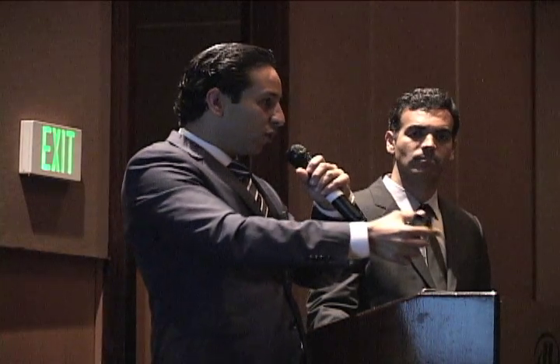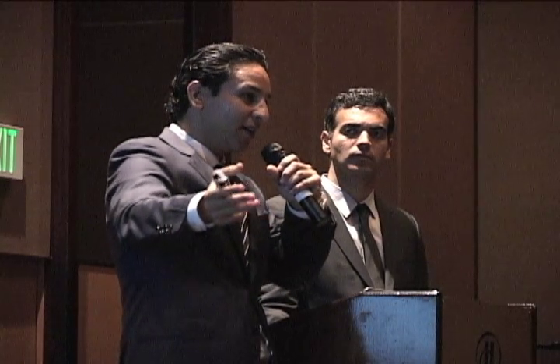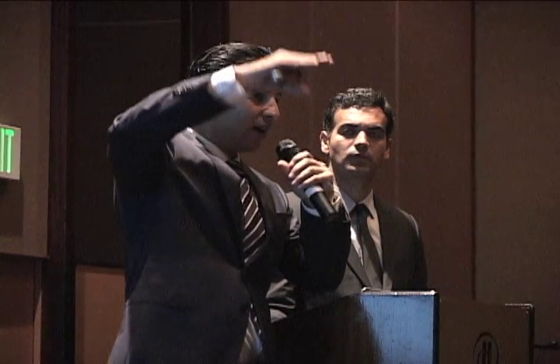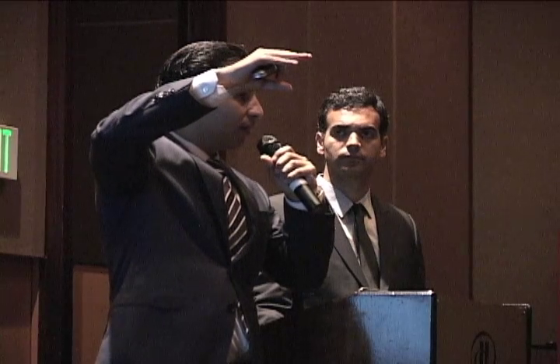And I see a lot of people who do bone grafts, they overfill the bone. Just because your assistant pours the whole bone, we should always be pouring the bone, because they don't know. They just put everything they have in the bottle. We don't want to waste bone. We don't want to waste anything as dentists. We put the bone, we pack it over, and now all of a sudden you have a high bone level, and the gum has to climb over this, and so it usually doesn't make it.